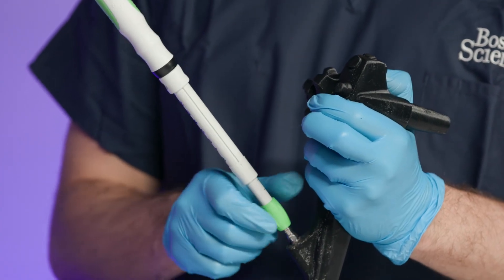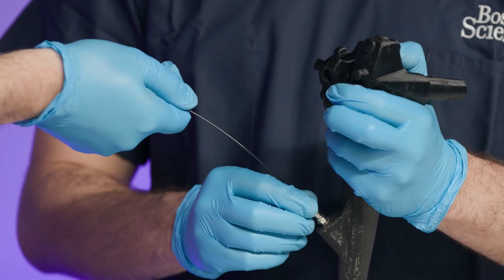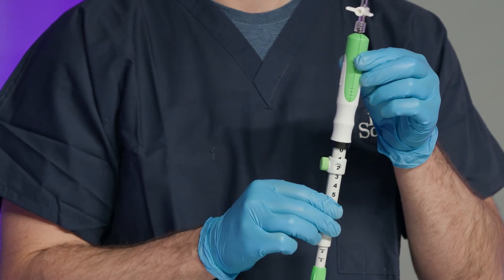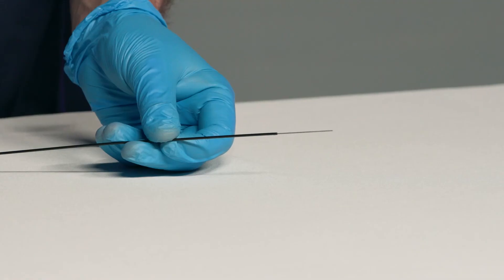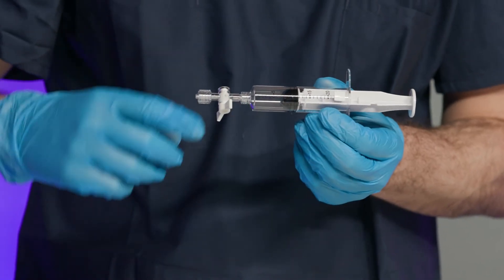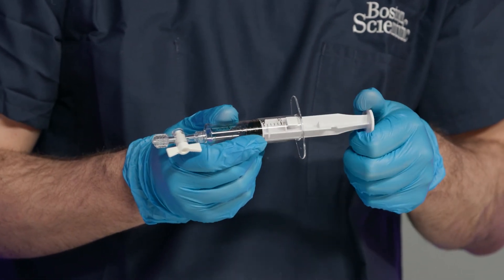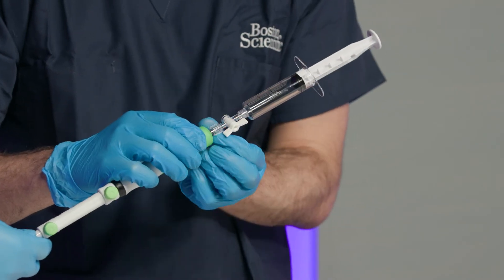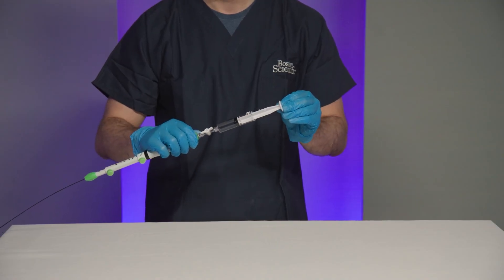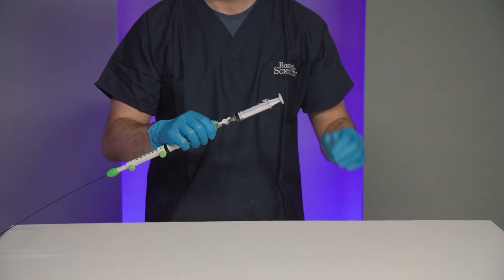Detach the device by turning the lure connection counterclockwise and remove the device from the echoendoscope. Release the needle adjustment lock and advance the device handle to extend the needle out of the sheath. Remove the syringe from the aspiration port, open the stopcock on the syringe and pull the syringe plunger back to pull air into the syringe. Reconnect the syringe to the aspiration port and push the syringe plunger forward to expel the sample from the needle. Prepare the sample per institutional protocol.